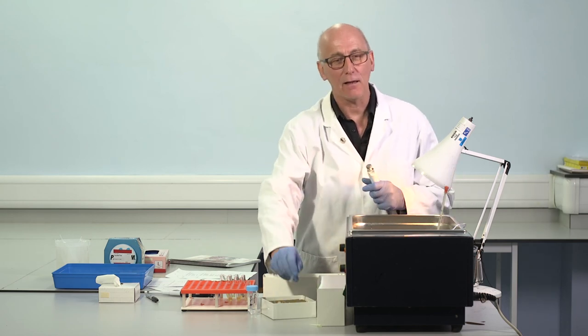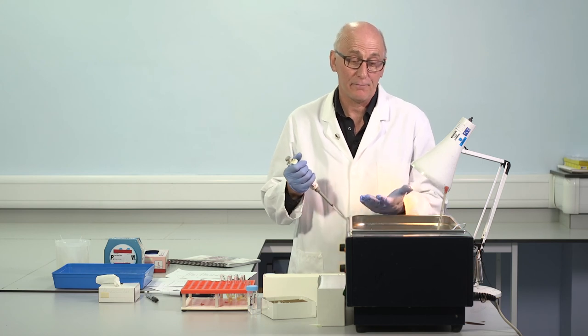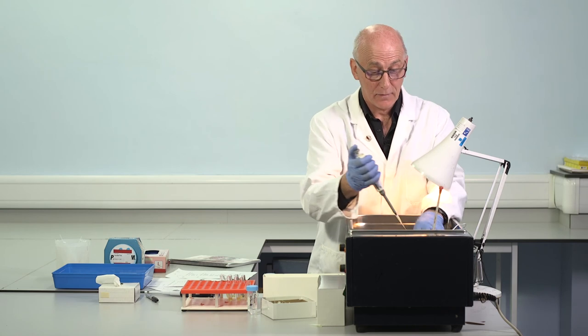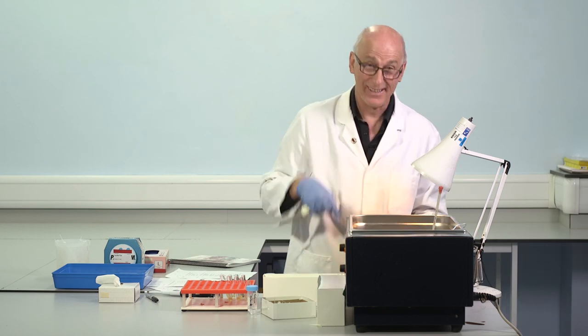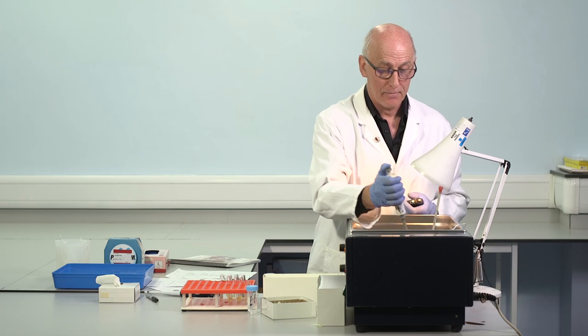So in particular, with mild haemophilia B in the 30 to 40 to 50 units per deciliter range, for even the very best APTT reagents, some of those patients will have a normal APTT. So once again, we can't use a normal APTT to exclude the presence of such a problem.